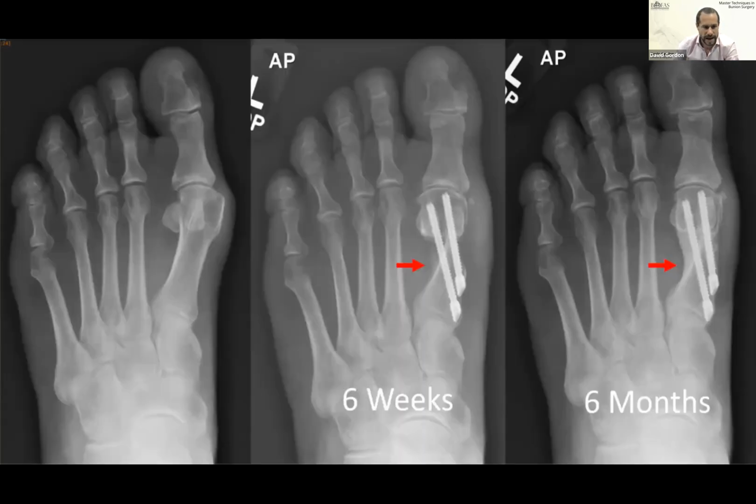And so in the middle, you've got a 6-week post-operative radiograph, and you can already see the sort of fluffy callus formation forming. You don't always see that at 6 weeks, but when you do, you know the patient's going to heal rather rapidly. And at the 6 months, you have excellent bone consolidation.